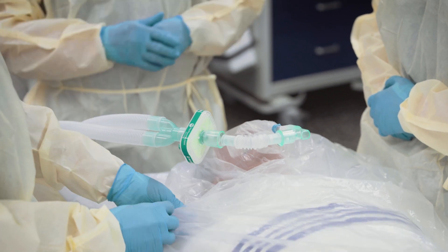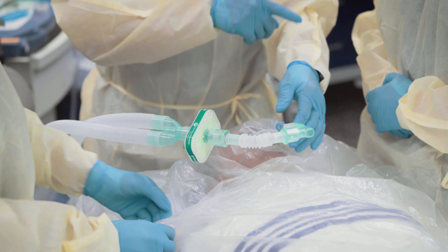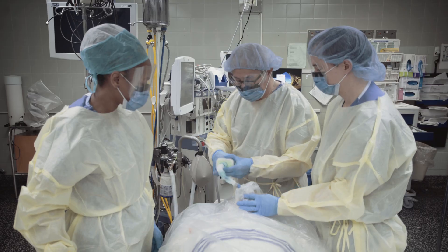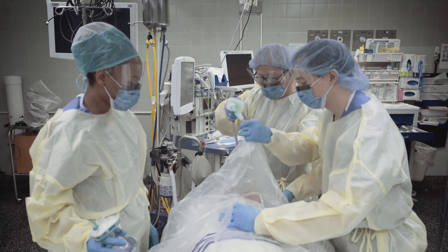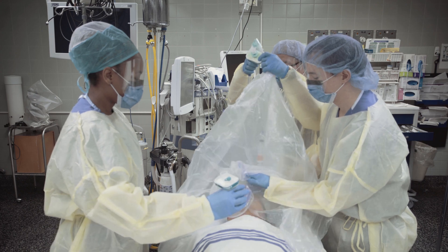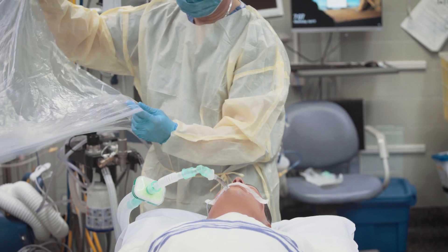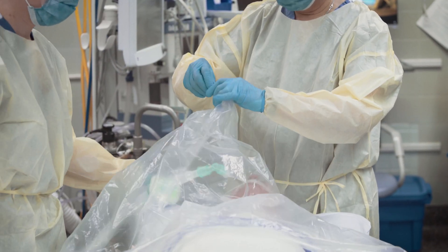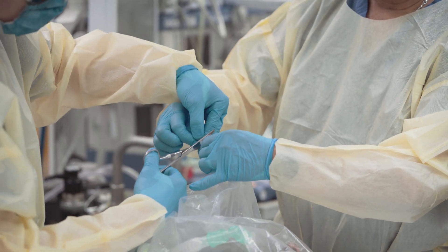Before tracheal extubation and while the patient is still paralyzed, we cover the patient's head with a clear plastic sheet to collect potential droplets. Our preference for plastic was a clear garbage bag, as the patient can still be clearly visualized. To begin, split the seam of one side of the bag. When open, place over the patient's head — the bag naturally falls into a tented position. Cut a small hole at the tip of the tent.